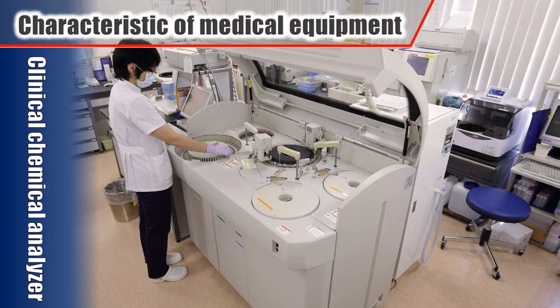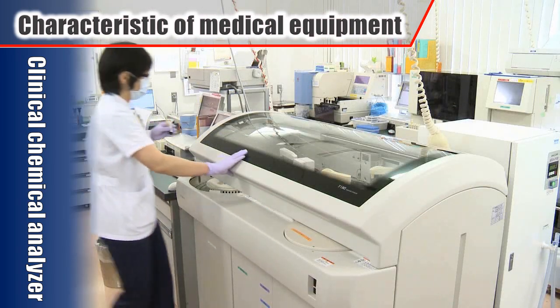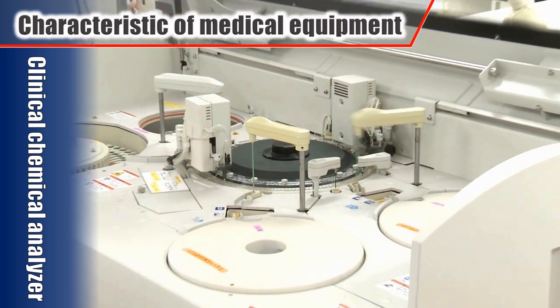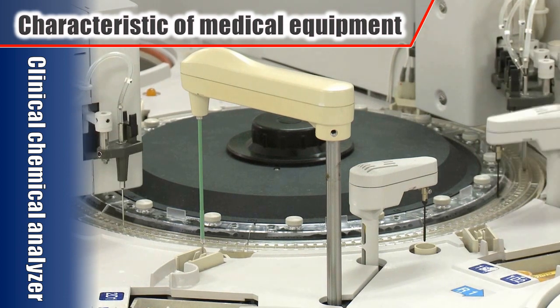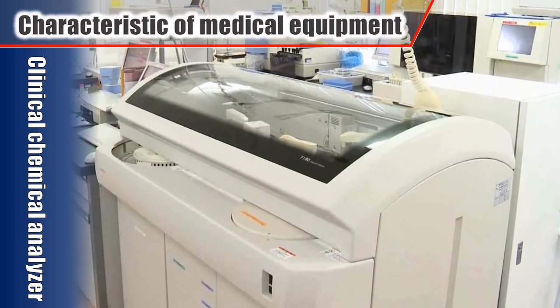First is the clinical chemical analyzer. The top part is the display section, and the bottom part includes the control system such as the power source and the circuit boards, as well as the drive system. It consists of aluminum partitions, galvanized steel frame, and small complicated brackets for mounting motors and sensors. Half of the material used are galvanized steel and stainless steel, and aluminum are also used. Many plastic parts compose the top exterior cover.